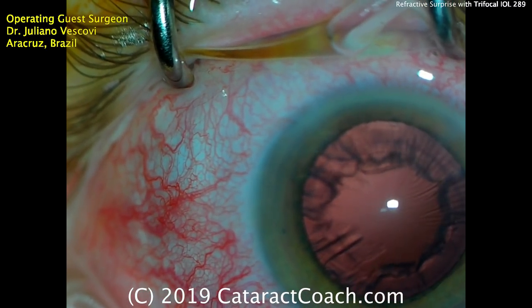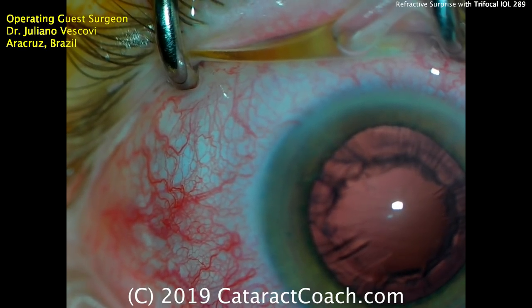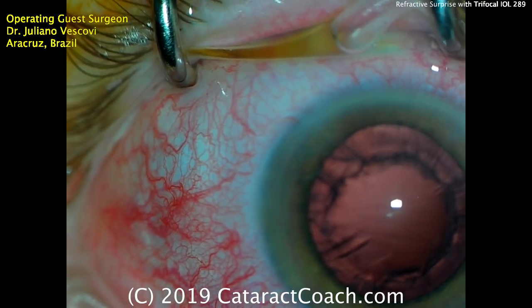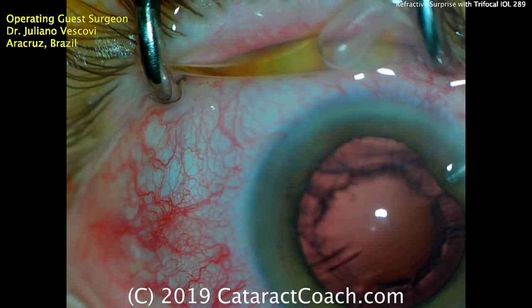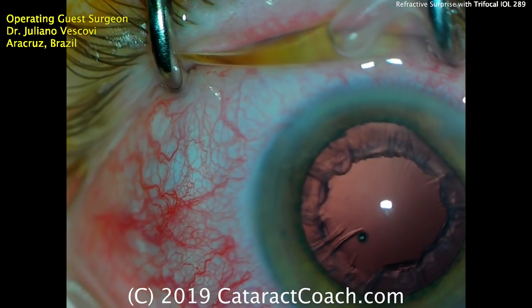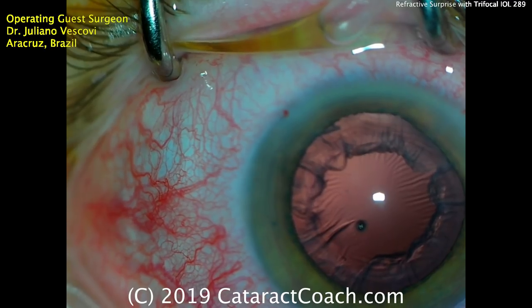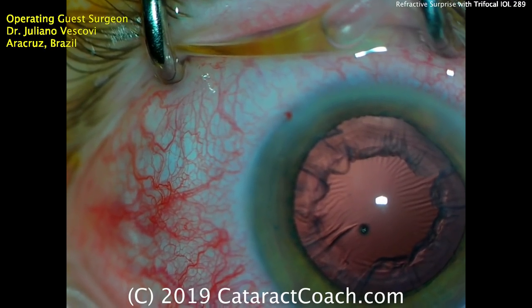Nucleus is out with a bare minimum amount of phaco energy. This patient will certainly have a clear cornea the very next morning. Now it's time for a little more viscoelastic, and then time for cortex removal.